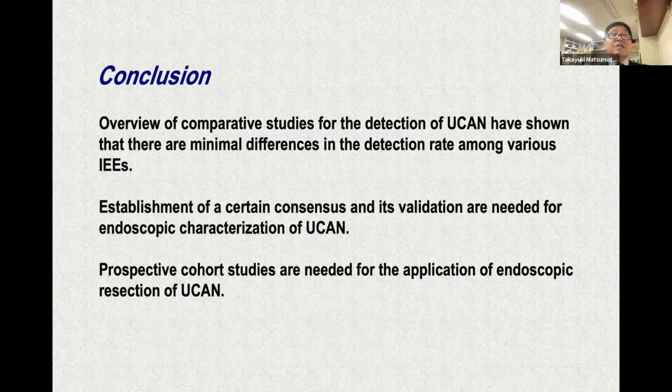And this is the final slide of my presentation. The overview of comparative studies for the detection of UC-associated neoplastic lesion have shown that there are minimal differences in the detection rate among various image-enhancing endoscopies or white light colonoscopy. An establishment of a certain consensus and its validation are needed for endoscopic characterization of UCAN. And finally, prospective cohort studies are needed for the application of endoscopic resection of UC-associated neoplasia.